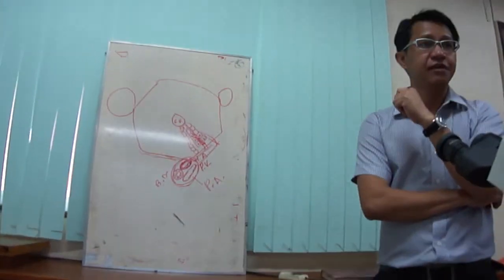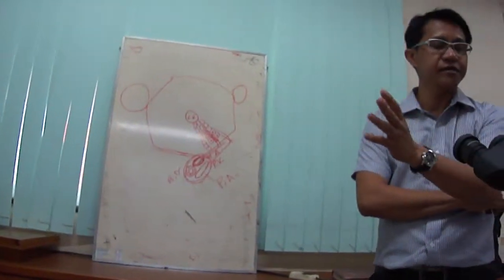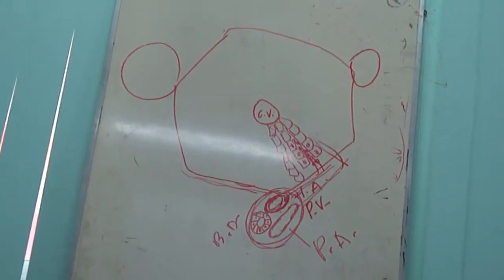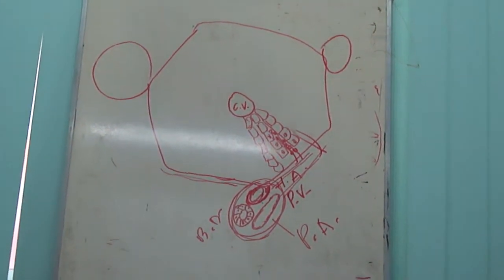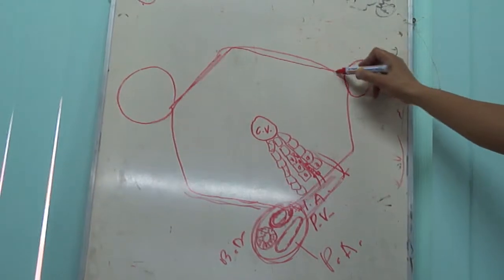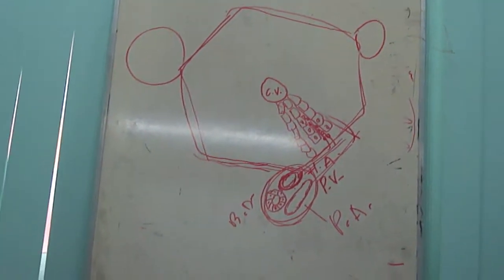Now, we'll begin with the liver. According to the book, there are several manners by which the cells from the liver are arranged. Now, we will limit ourselves to the easily identified one in light microscopy, the hepatic lobule. Okay? So, more or less, a hepatic lobule will have a polygonal appearance. So, most of the time, especially in lower forms of mammals, na liver, hexagonal ang kanyang shape ng hepatic lobule.